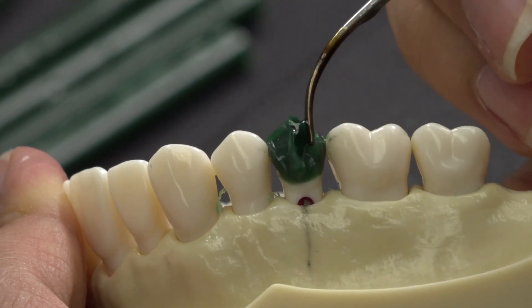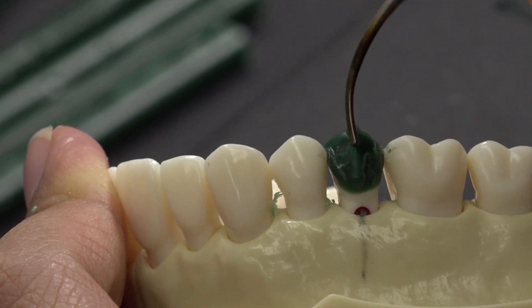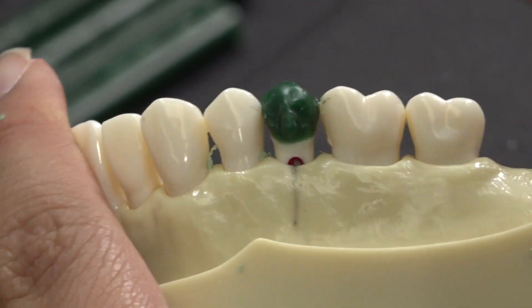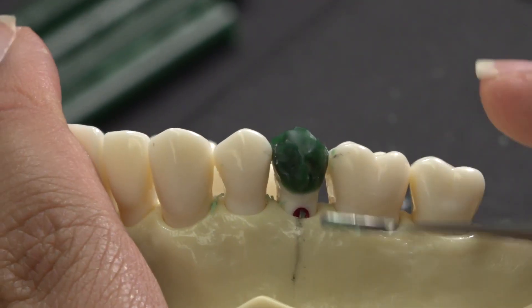I like to add a line of wax in the middle to help create a 3D diamond effect. Then I use a hot PKT to smooth out the wax. Make sure that the facial is not sticking out further than tooth number 5 by using a flat instrument to measure.